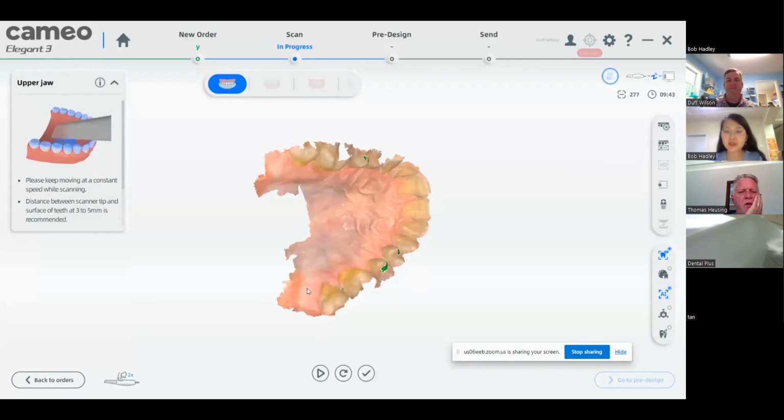Yes, Doc. So there's no name. So who is the support team for USA for the scanner for the doctors? And what time frames?